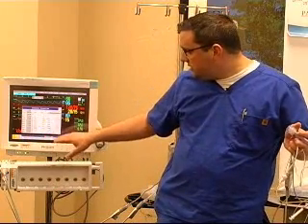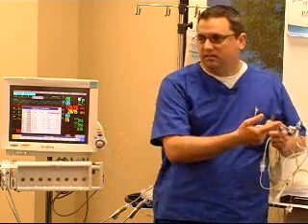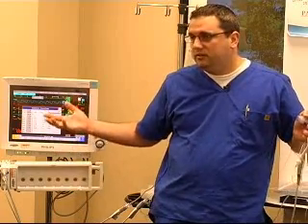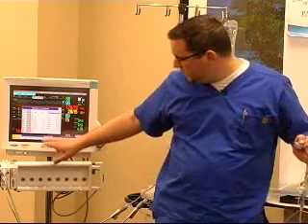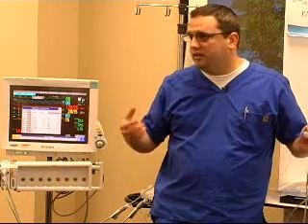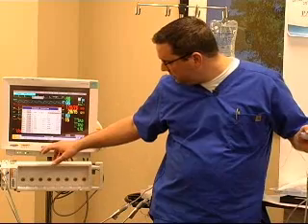So hemocalculation, or hemodynamic calculation. Let's say, see, I forgot to zero my CVP. So my CVP on here, say it's 300. So all I have to do is just go over here and turn this, wait a few seconds, let it correct itself, and then I'm going to say resample vitals, which is right there, and it'll pull in the correct number, okay?